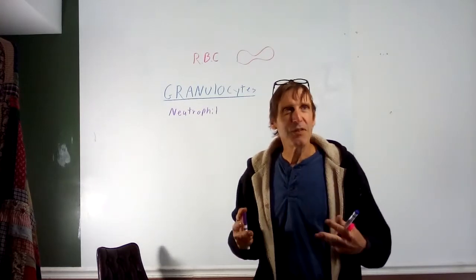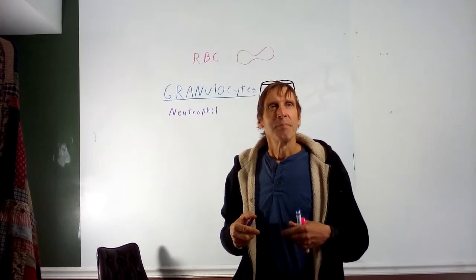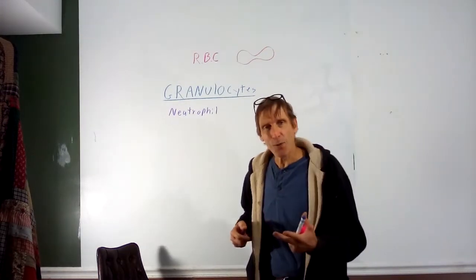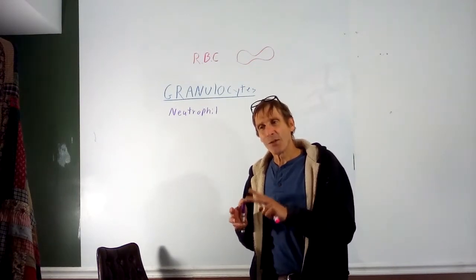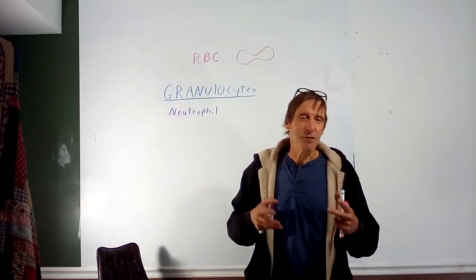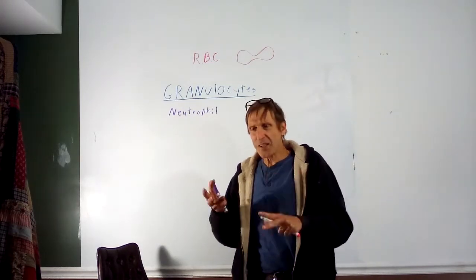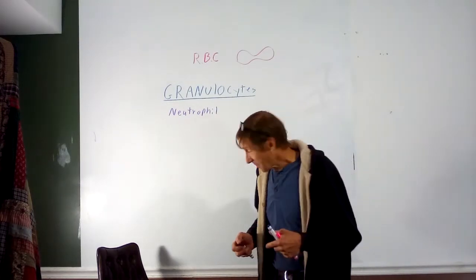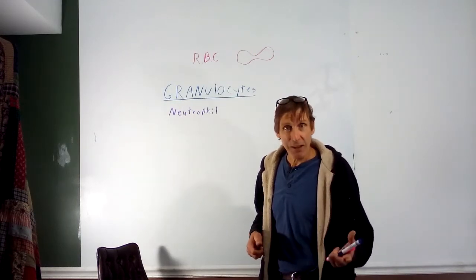Also, just give me a brief, 1 or 2 word function, perhaps, and their relative frequency. One of the things they do with white blood cells, they can use them diagnostically. Certain white blood cells play a role in fighting off different types of infections like bacterial, viral, parasitic. And so if they see these numbers shifting, it gives them some idea of what might be ailing you. So I'll give you a brief function and a description and their relative frequency.